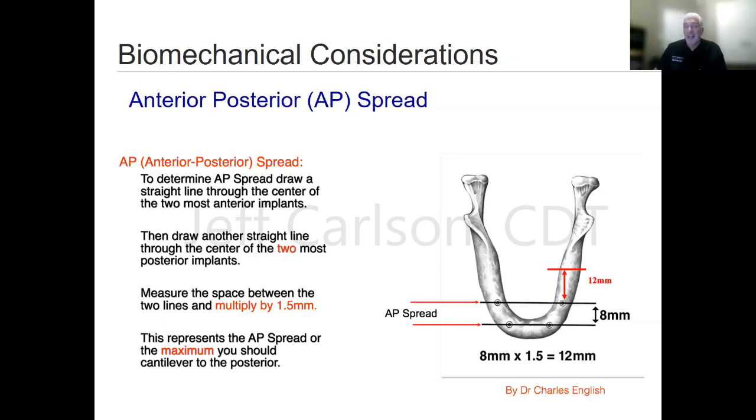Something to think about. That could be more advantageous on a prosthesis to have 1 bicuspid and 2 molars, because you have a better surface area, better chewing efficiency, and that actually could be less stress to the prosthesis and to the system, being prosthesis, implant abutment interface, implant to bone interface. Because they're more efficient, they're not having to chew as much as maybe 2 bicuspids and a molar. Got off sidetrack there, but I wanted to throw that out to you.